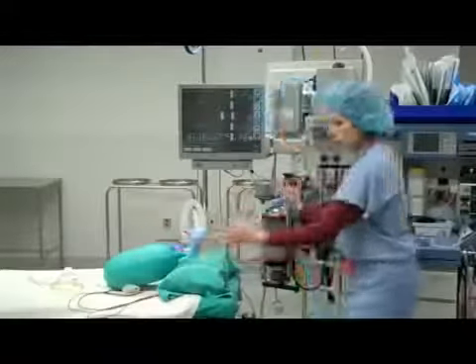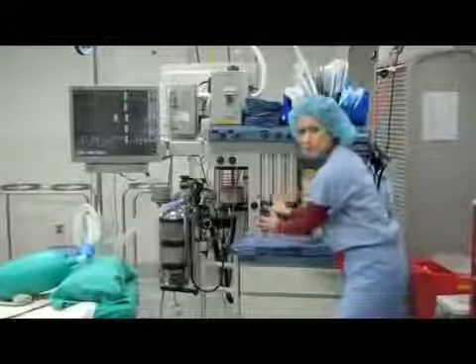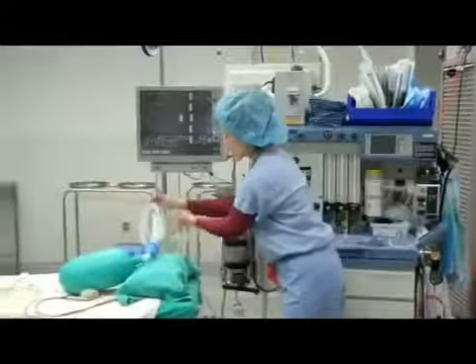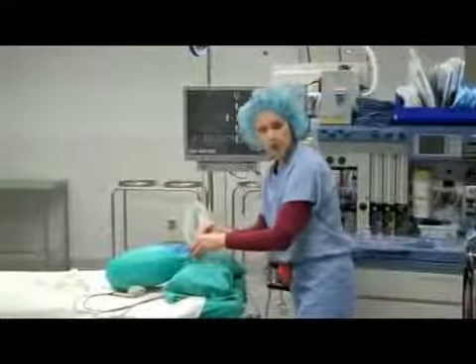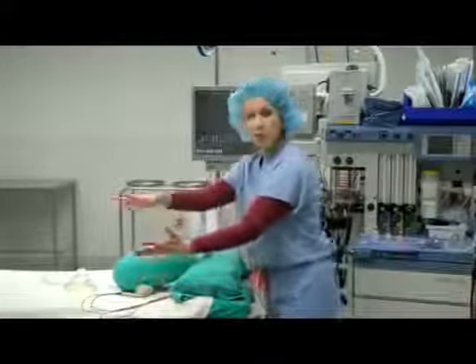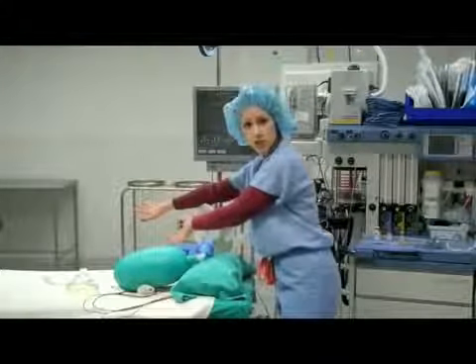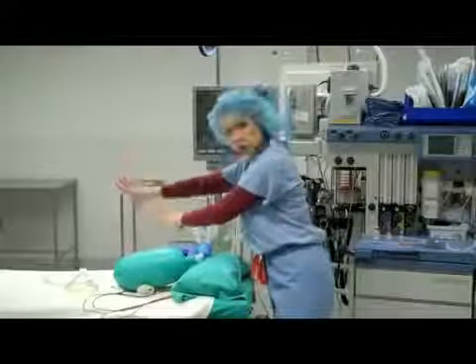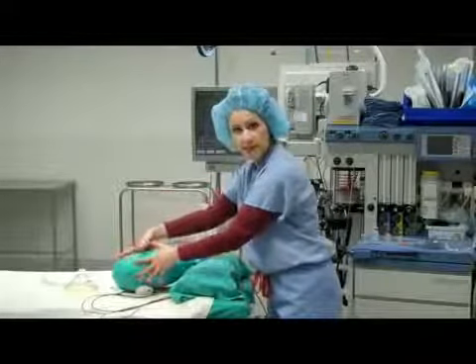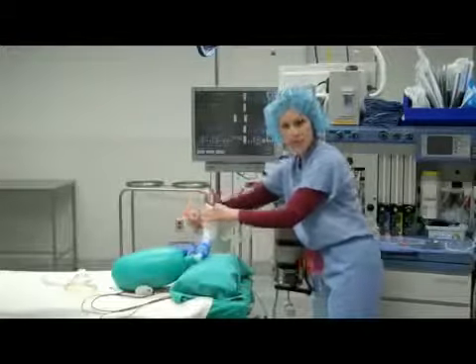And so to recap, we have anesthesia gas being sent through the anesthesia machine into this side of our circuit. The gas travels through the breathing tube, which is in the patient's mouth at this point, into the lung. Okay? The bloodstream then picks the anesthesia gas up from the lung and delivers it to the tissues. On return, the bloodstream picks up the gas from the tissues and brings it back to the lungs. The gas is then extracted out. It comes out the other side of our breathing circuit.